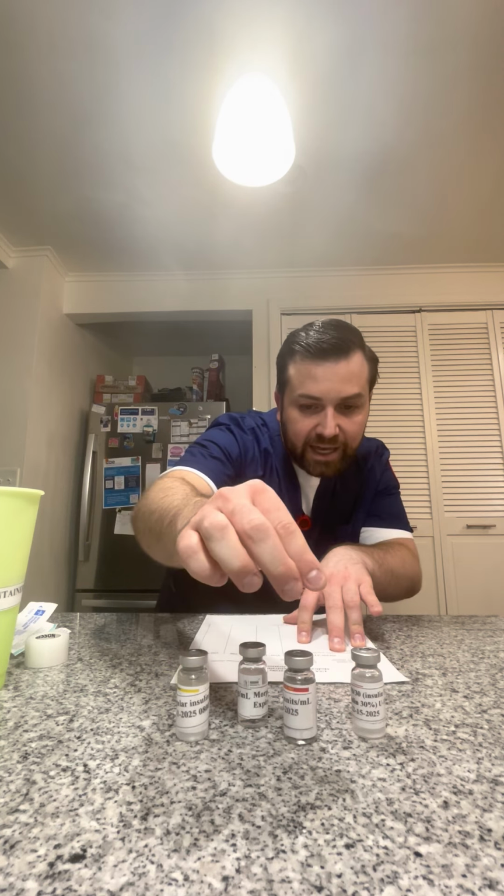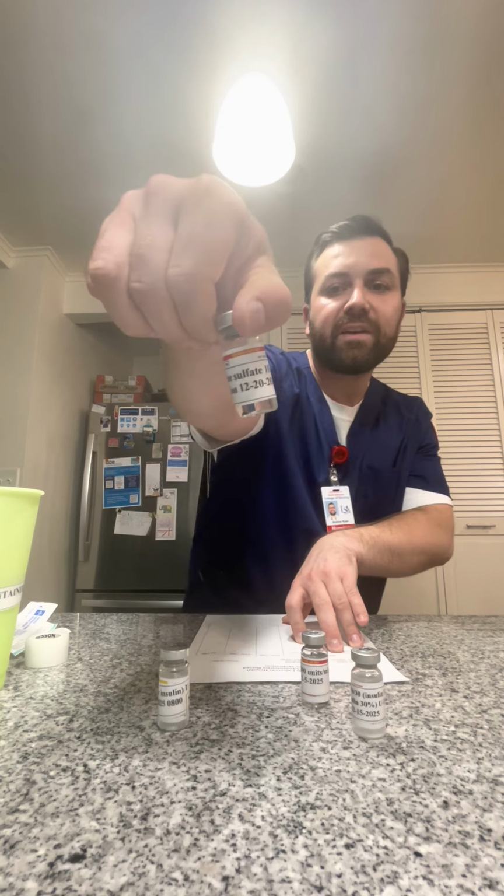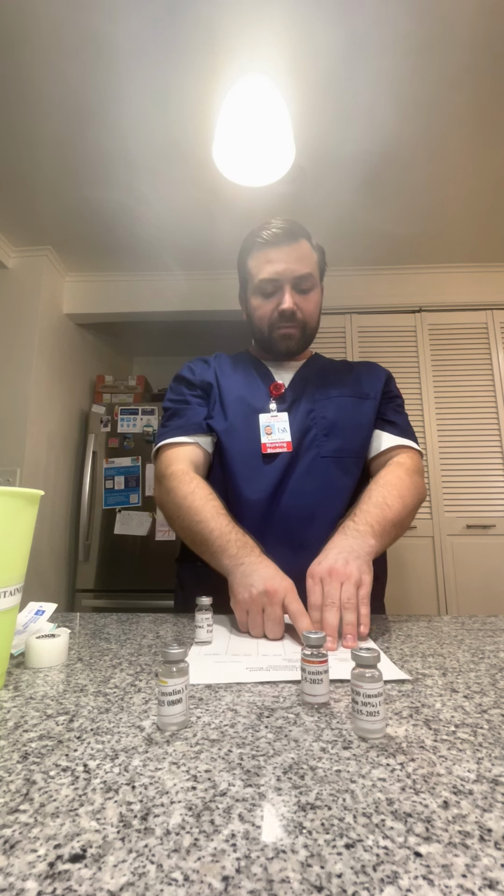I'm going to go ahead with the first check and do this at the same time. We have morphine sulfate, 10 milligrams per milliliter. The dose is 5 milligrams, but after doing the calculations, I'll be administering 0.5 milliliters, and I did check that with another nurse.